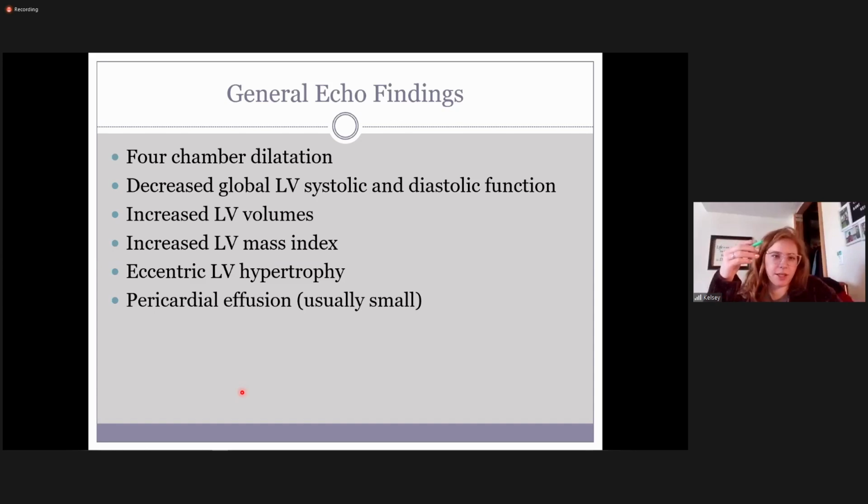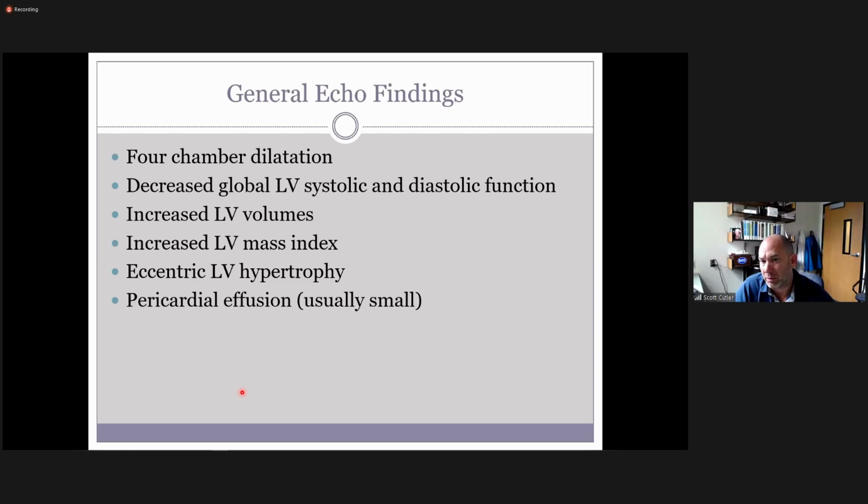Would that be more related to the effects of coronary artery disease and the opposite segment compensating? Well, if we see that though, then we've diagnosed ischemic cardiomyopathy, and you're going to see a weakening. Generally the whole thing is poorly functioning, and you might have some thickened segments, but they are squeezing.